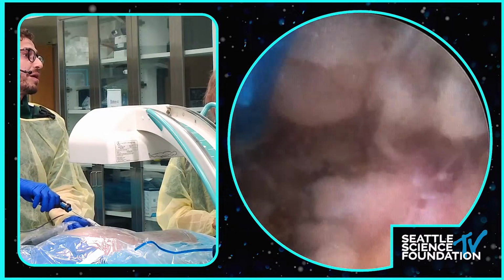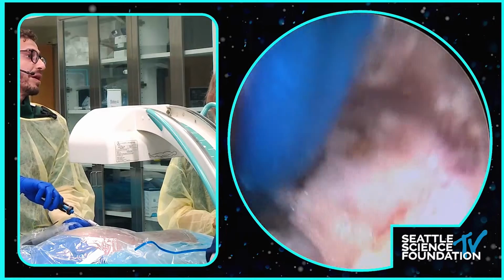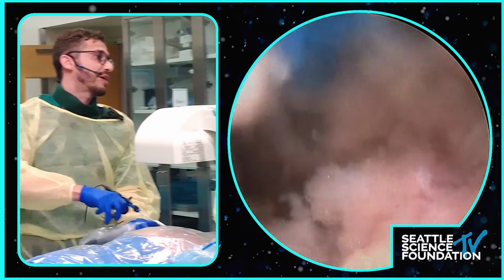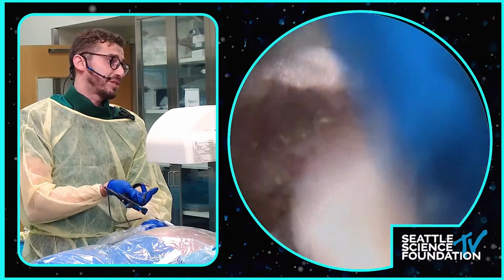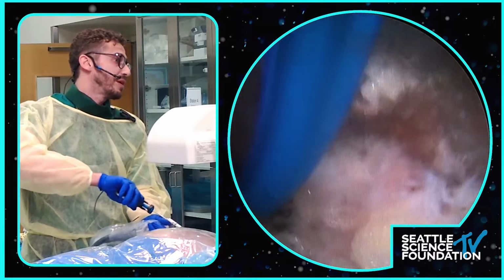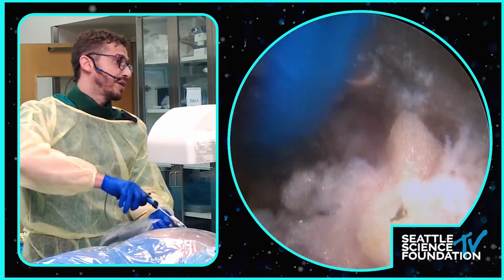Putting the scope in, I see that, and I know I'm on the right track. And here, I'm going to get a better picture of it. This is the pedicle. I feel it there. And this over here is the SAP. This is where the disc fragment would be. So this over here is pedicle, right here. SAP is down here, and this is going into the epidural space.